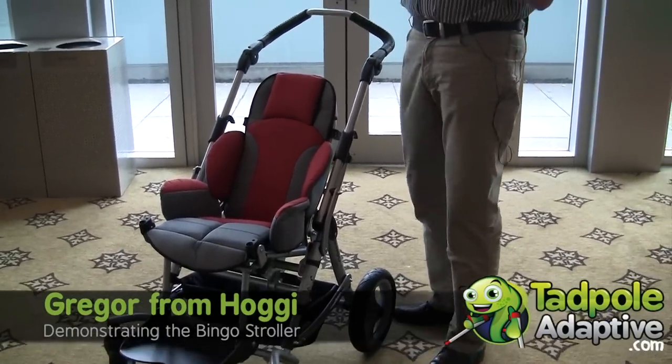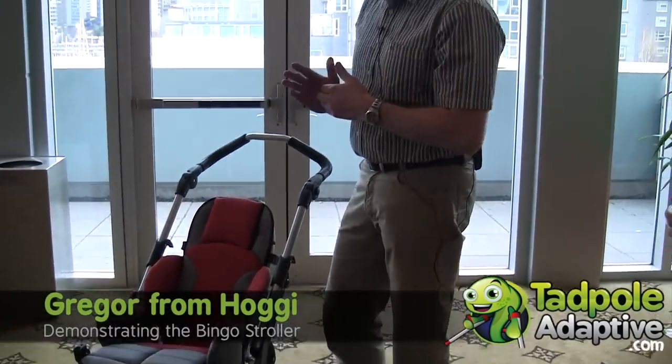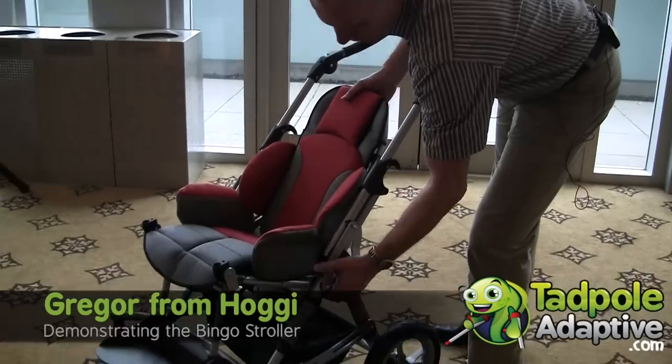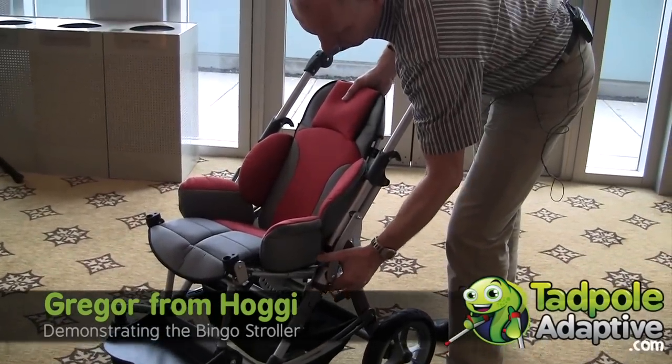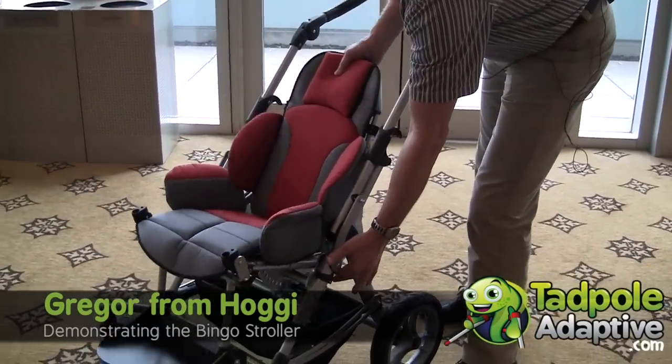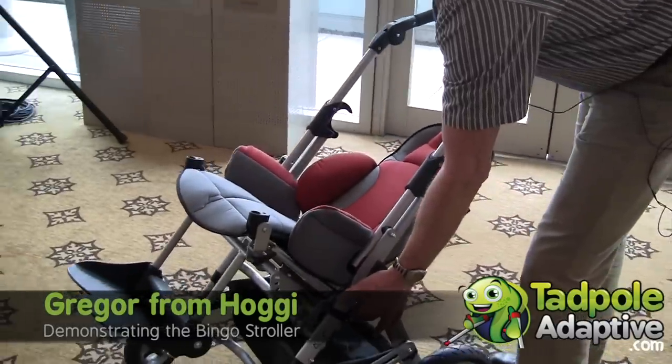What is very important for a child with special needs is to give a tilt — it's the most important function. So we turn this lever, pull it up, and then we have the tilt possibility up to 45 degrees.